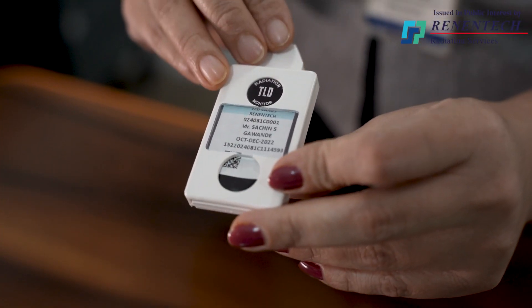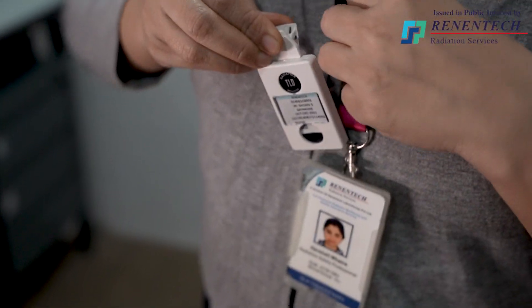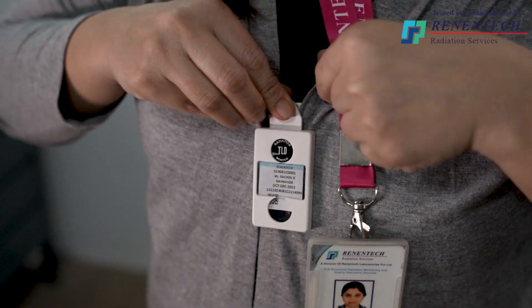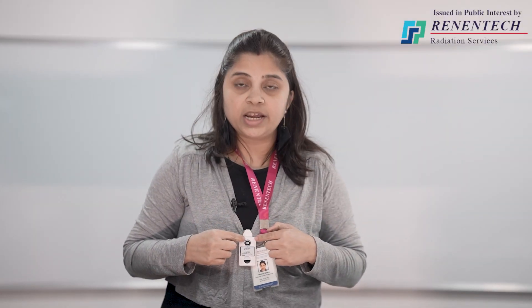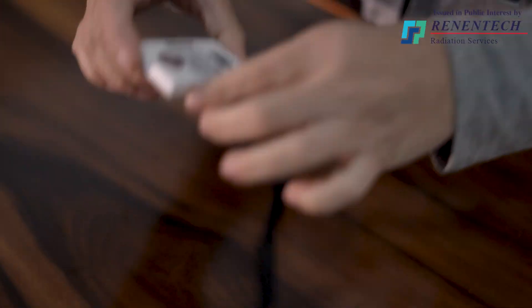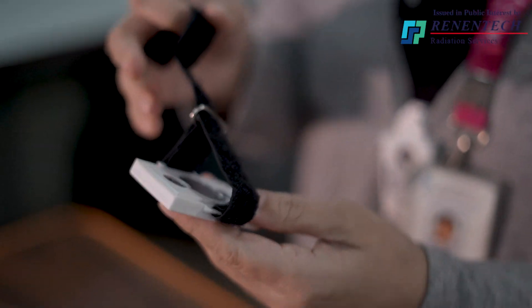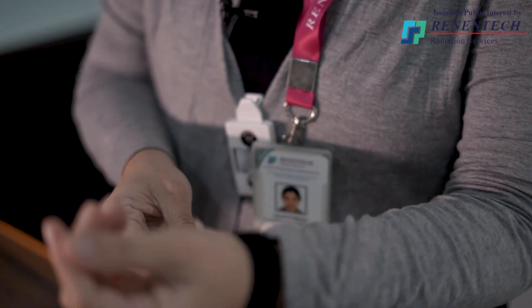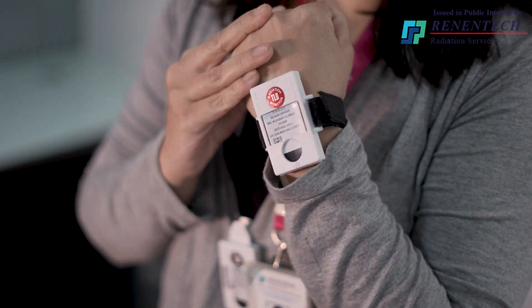How should the TLD badge be worn? Let us begin with the chest badge. This is the chest cassette with the chest card inserted. Since it is a chest card, it always has to be worn on the chest level because it will measure the whole body dose — that is from head to toe. Likewise, the wrist badge has to be tied on the wrist itself, just as we tie a watch on the wrist.